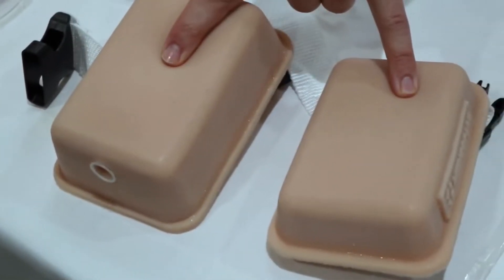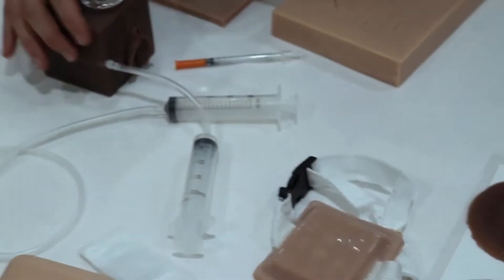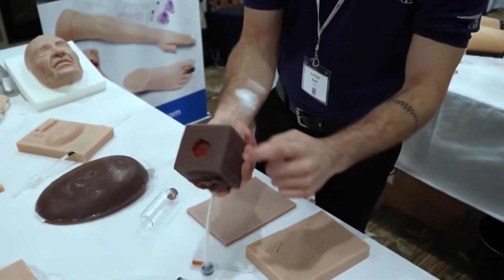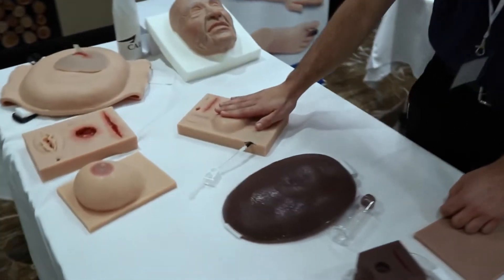We have variations of injection pads, including an intradermal pad as well. We also have trainers for distance learning — our multi cubes with various tasks to be learned on them, as well as our multi pads.